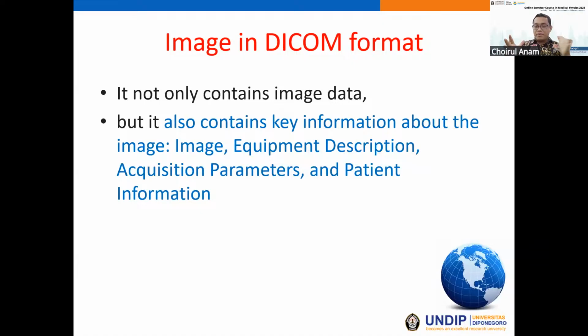Therefore, the information should be stored in the image itself, to avoid misinformation about the patient. And the DICOM format is standardized. So for every vendor, such as Siemens and GE, although they have different techniques, the image should be in a standardized manner.